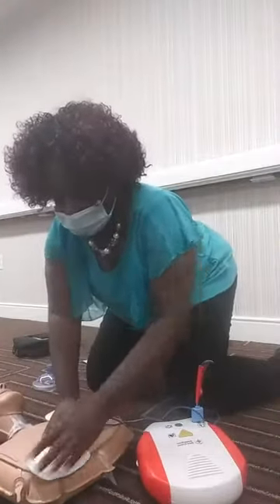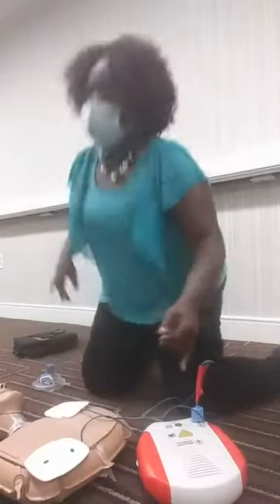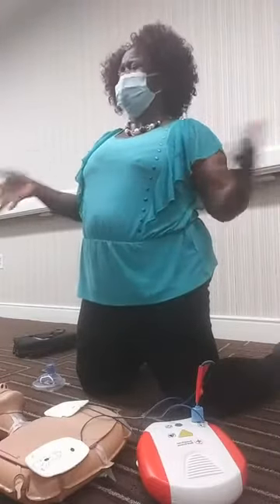Normally when the rescue team comes, they will usually take over compressions. That beat you hear is also the rhythm in which you do your compressions — either that or you can think about the song 'Stayin' Alive.'